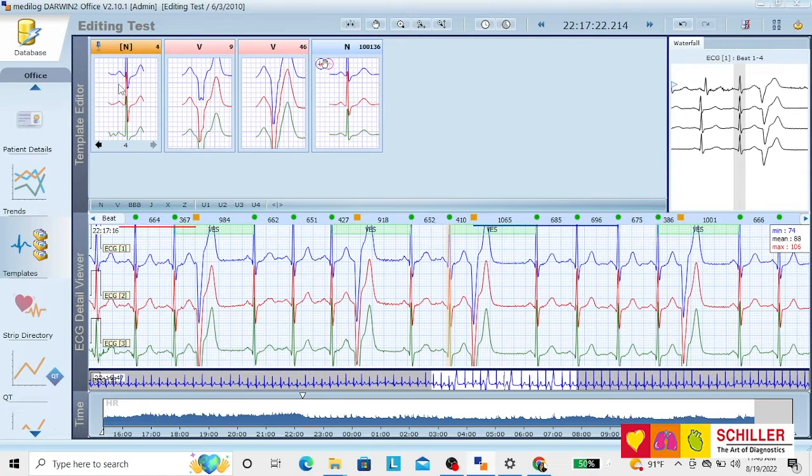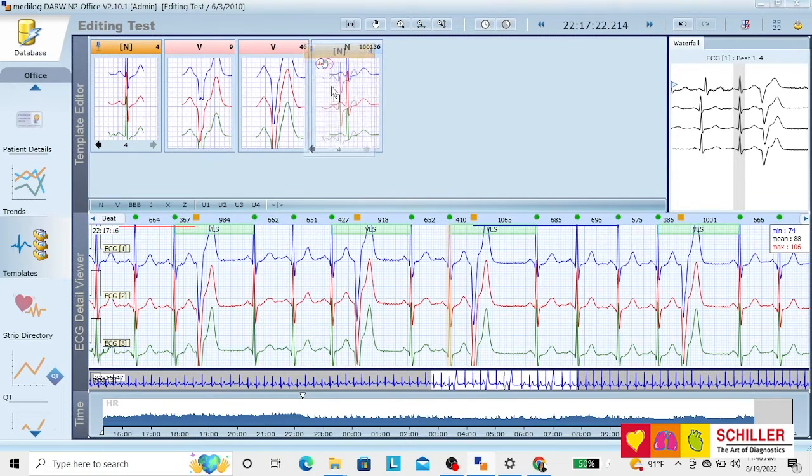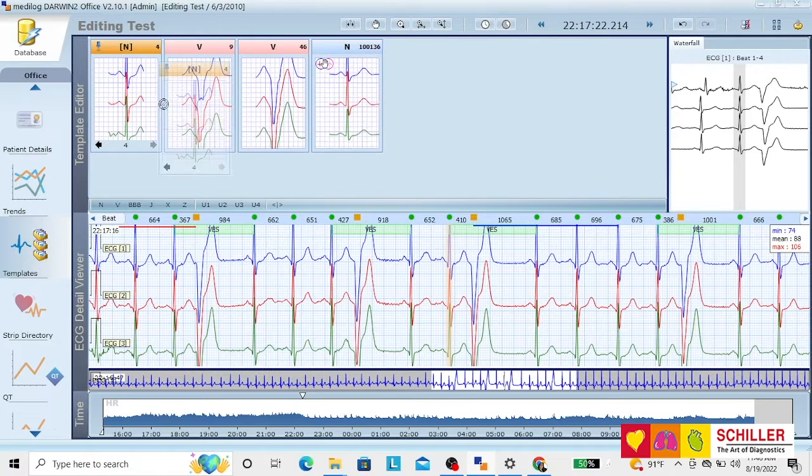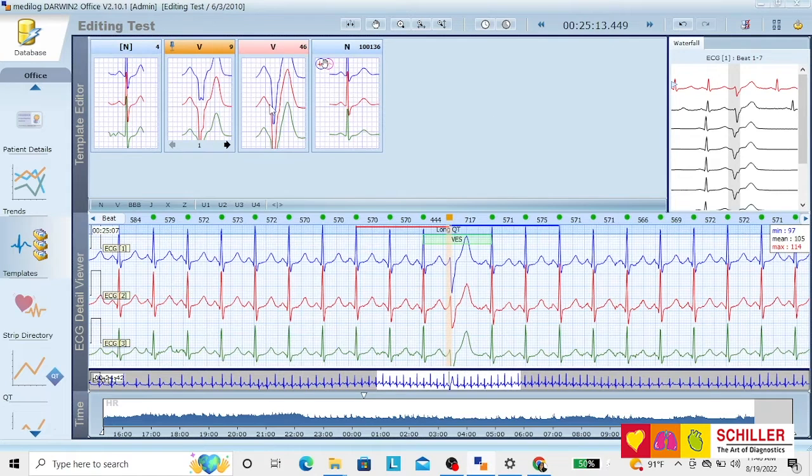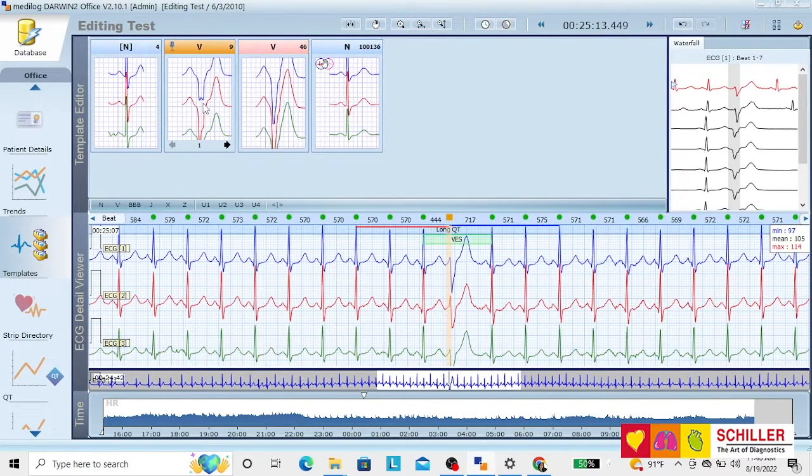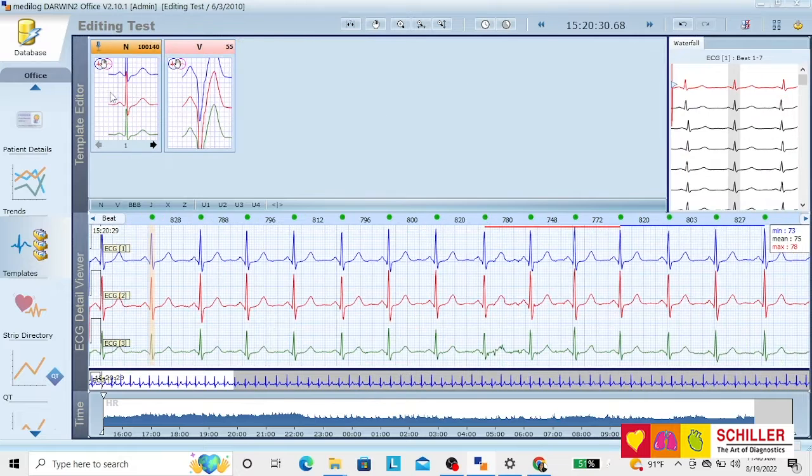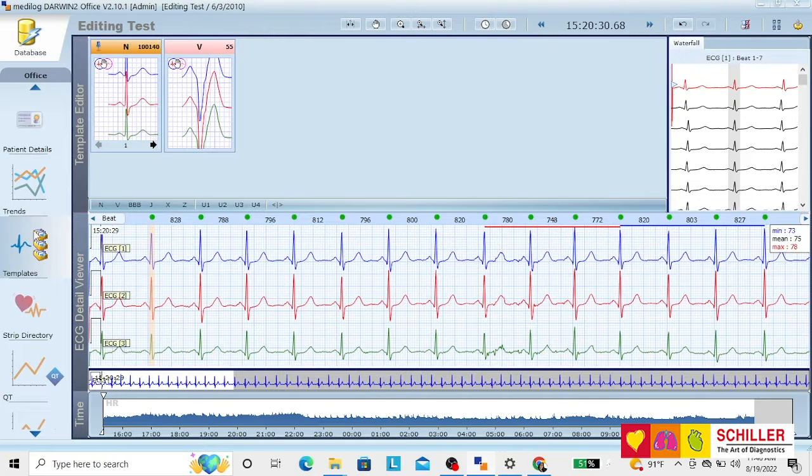We can either keep them separate or drag and drop to the normal beats. As for the ventricular beats, we can see that the morphologies are the same kind of beats, just drag and drop. There you have everything together. We have just put the normals here.